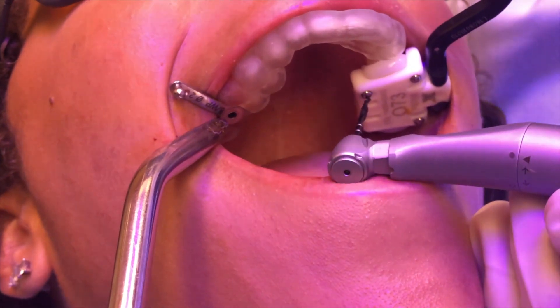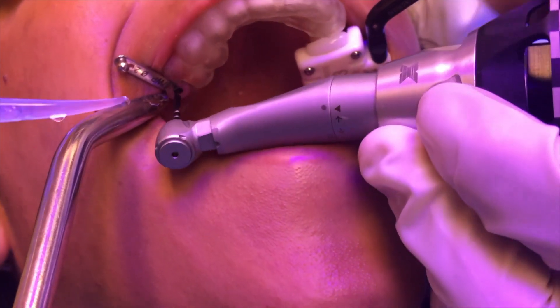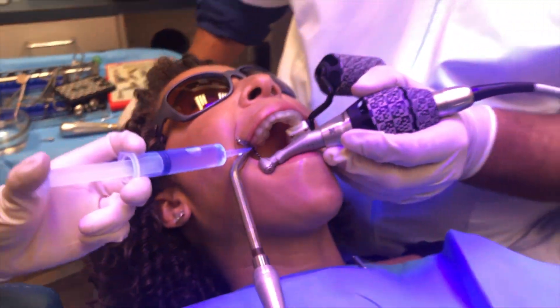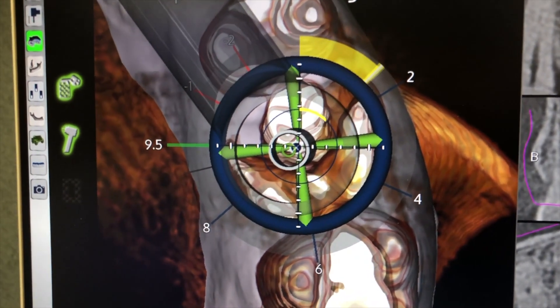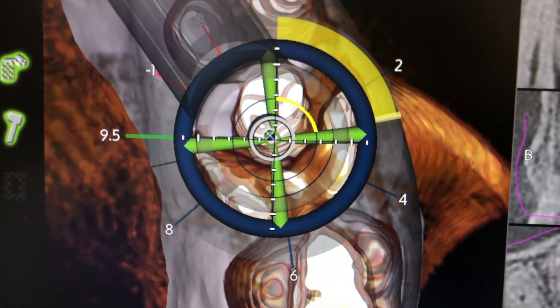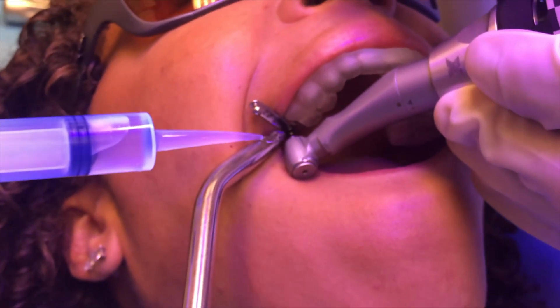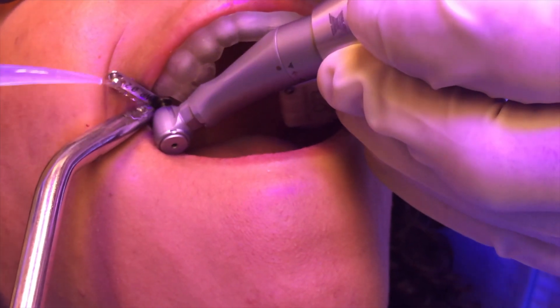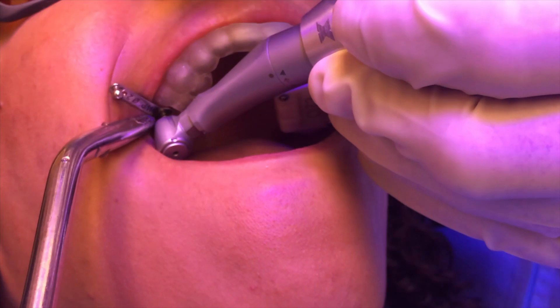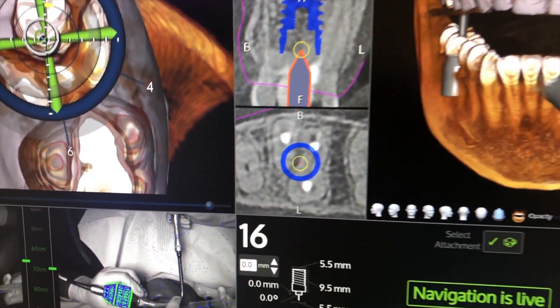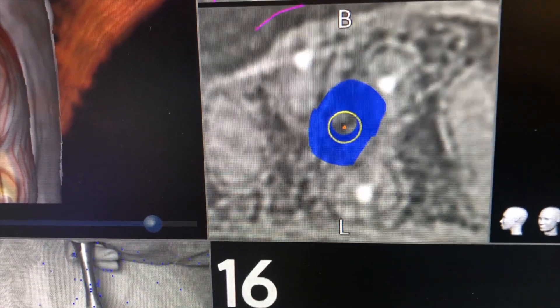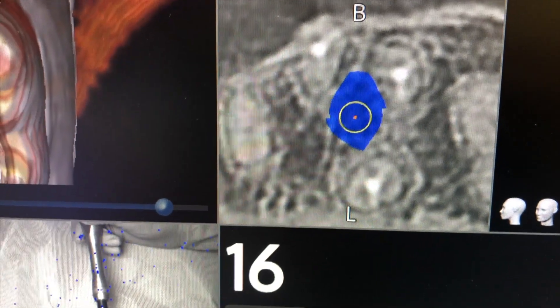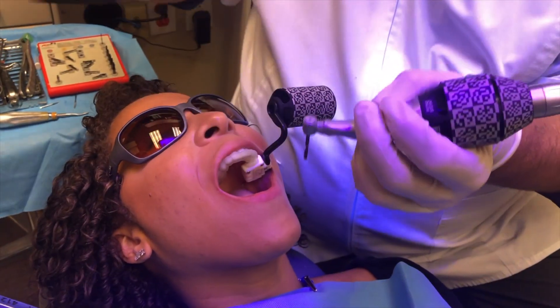You can see I'm checking and verifying that the X-guide is actually working — you would usually touch this on the adjacent teeth. Since I have a posterior tooth, I can do that. We can see the drill going in, and the yellow is showing how deep we're going — about three millimeters depth. As we go in, we can actually feel the base of the sinus, and I'm going to just penetrate that a little bit to get the tip to grab into the stable bone. The blue shows the implant model that's been planned, and you can see the drill position in the guide lining up exactly.